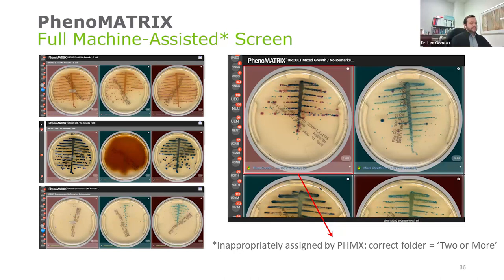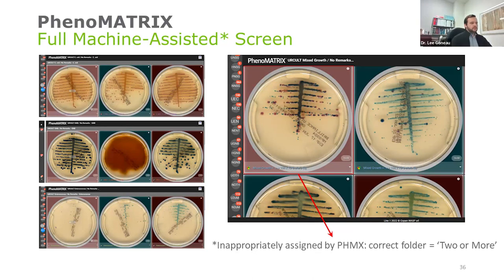I say machine-assisted screening because I want to highlight that it's not perfect. It is based on a machine learning algorithm, and there are limitations within the software. Here's an example of one plate that was put into the mixed growth folder, which should have been assigned to the two-or-more folder. I want to reassure everybody that there are MLTs screening all of the Phenomatrix results to make sure they've been grouped into the proper folder before the workflow is assigned and results are finalized.